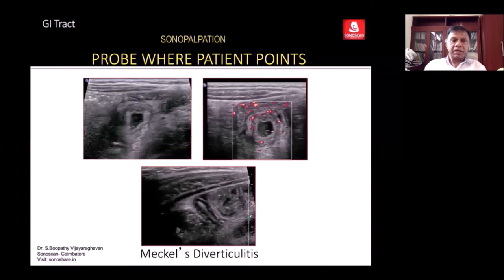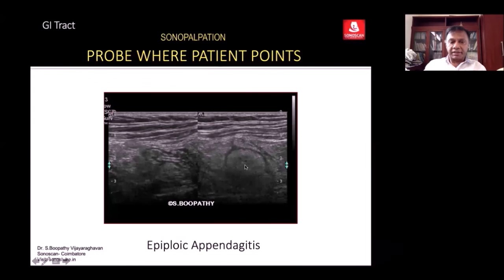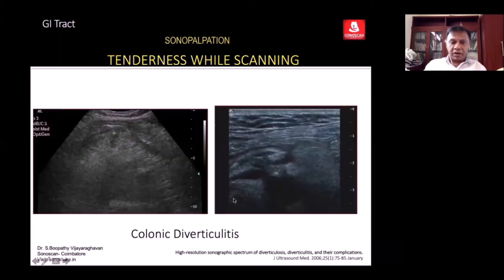The protocol involves the patient pointing to where they have pain — this is a very useful technique. The second approach is sonopalpation using the ultrasound probe. By sonopalpation, with the patient pointing to the point of pain, you see a thick-walled bowel loop with a central echogenic area, a hypoechoic rim all around, and echogenic fat surrounding it.